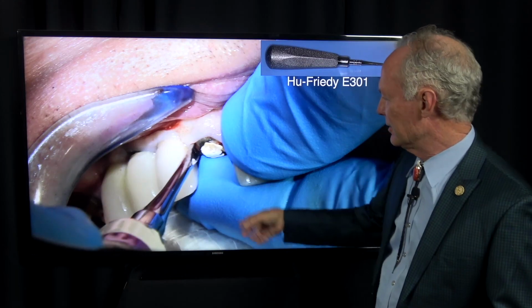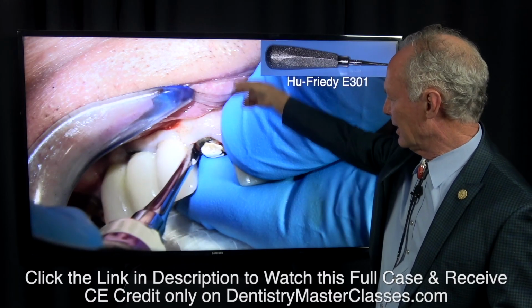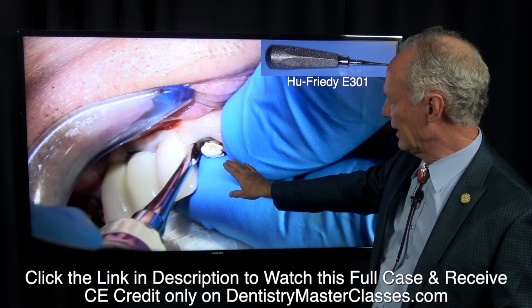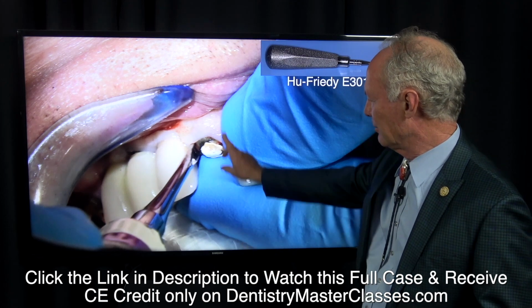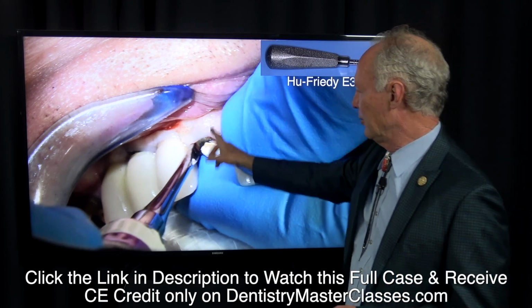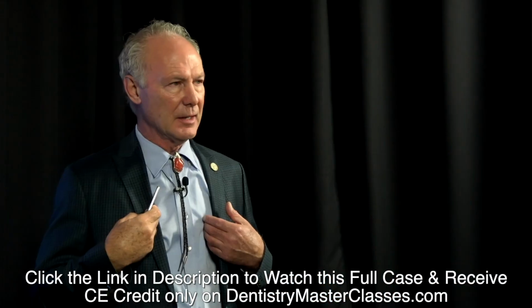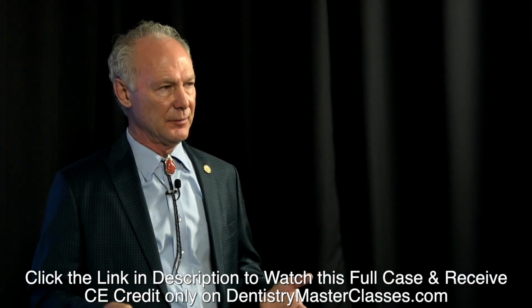If it's a single-rooted tooth, I would prefer to place the implant at the time of extraction. Why? The socket is there. The guide for the implant is there. If the tooth was located in the correct position, you've got a perfect little cylinder into which to place the implant. Now, if it's a multi-rooted tooth, I don't ever place the implant at the time of extraction.